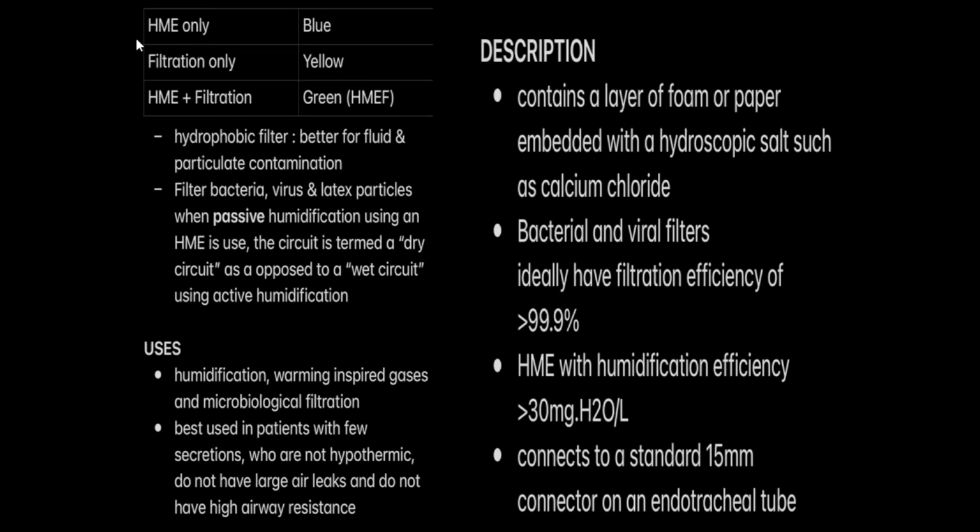Sorry, filtration only. HME only is blue. You might have seen in some places, there is an HME-only, blue-colored thing. Okay, I think I have a picture of it. What is important, you must know the filter is hydrophobic, which means better for fluid and particulate contact. It means it expels the water. It filters bacteria, virus, and latex particles when passive humidification using an HME is used.